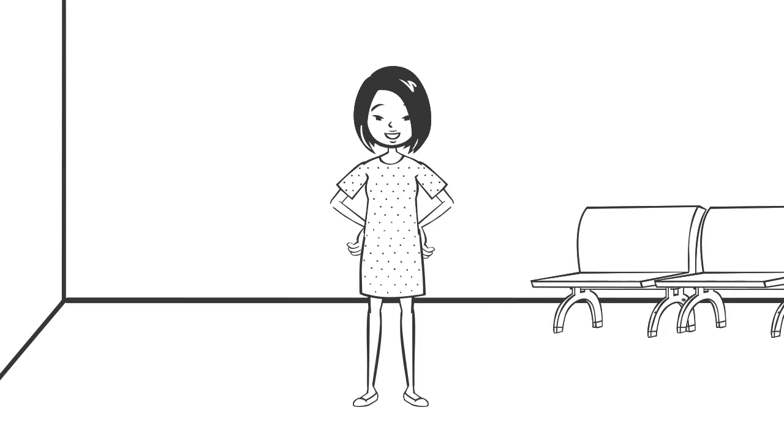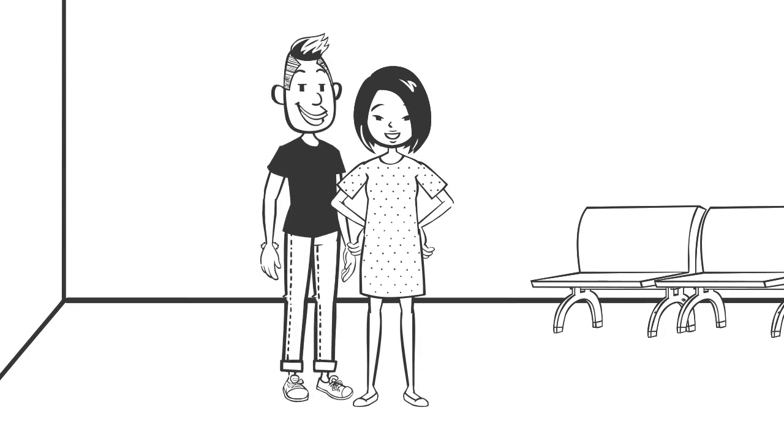Although the radiographer will leave the room during your scan, it may be possible to have a friend or family member with you in the MRI room for support. Just like you, they will not be able to enter the room if they have a pacemaker or any metal implants, and will be asked to remove any metal items from their body.